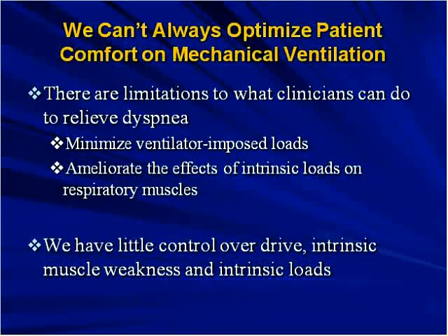And lastly, we can't always optimize patient comfort on mechanical ventilation. There are limits to what we can do to relieve dyspnea, and sometimes we just have to rely on sedation, particularly in patients that are very, very critically ill. It's always a balancing act.